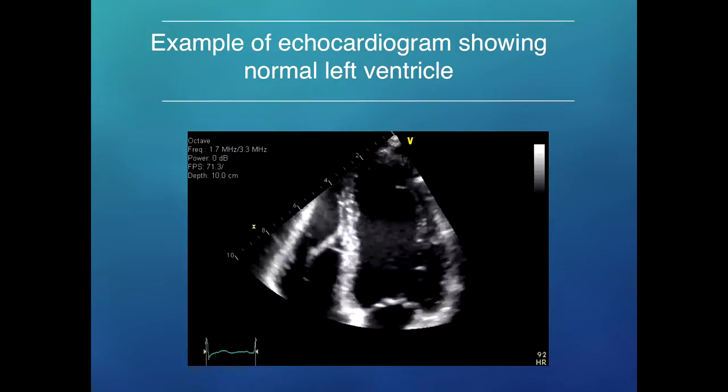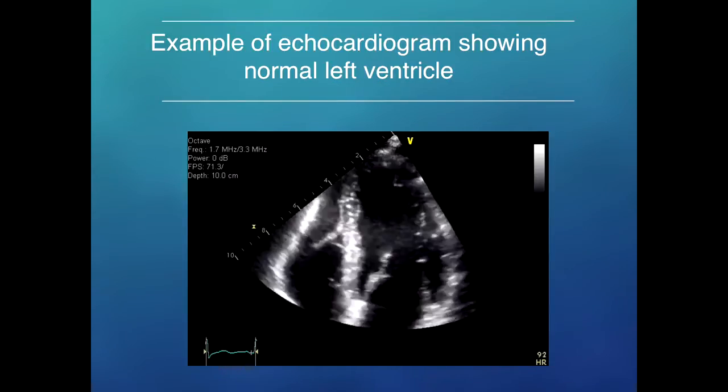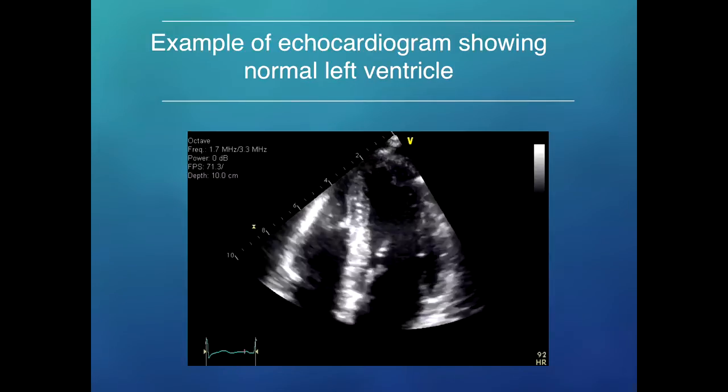And this is a normal heart, and you can see that all of the walls are moving symmetrically, and so the walls and the muscle is shown in white, and the black here is the blood. And what you see is that on an echocardiogram, we actually don't see the blood directly. So what we see is we see the walls. We can try and infer what we think the blood is doing, but we don't actually see it. And a normal heart like this squeezes out about 2/3 of the blood from the left ventricle with each heartbeat, okay? And so that's a normal heart.